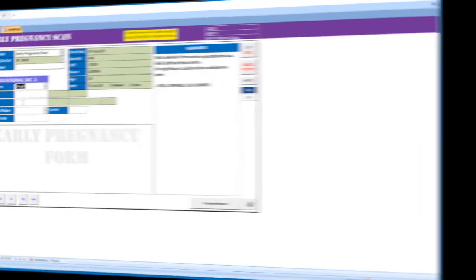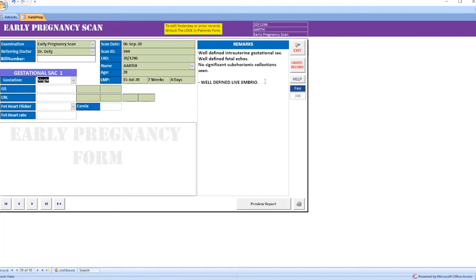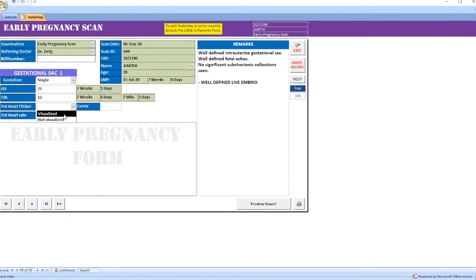If it is a single sac, select here. The template for a single pregnancy is copied here. Enter GS — the fetal age is calculated here automatically. Enter CRL — the fetal age is calculated and fetal heart flicker visualized, then enter the fetal heart rate.